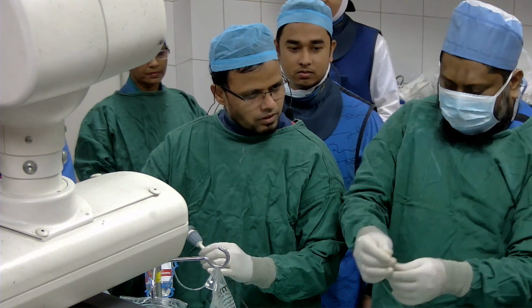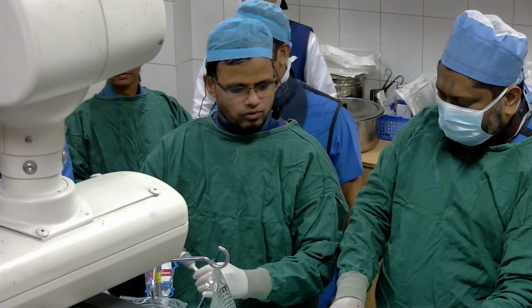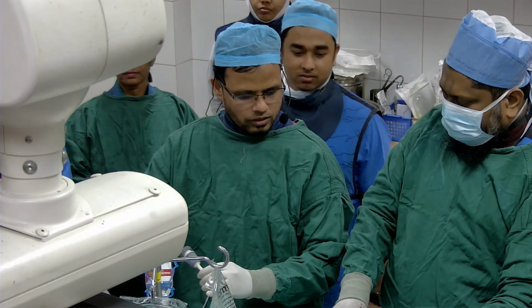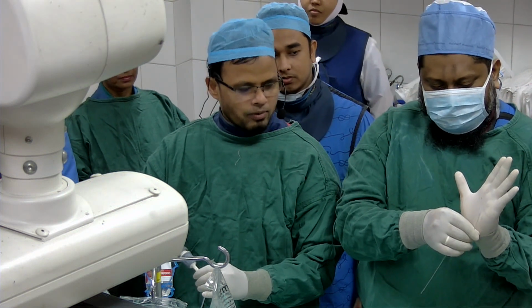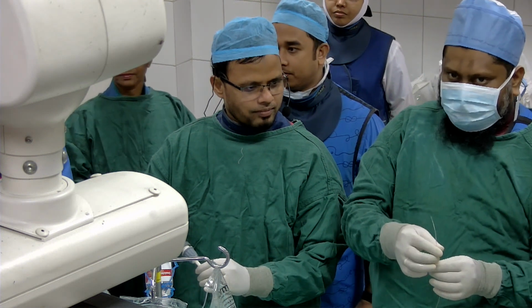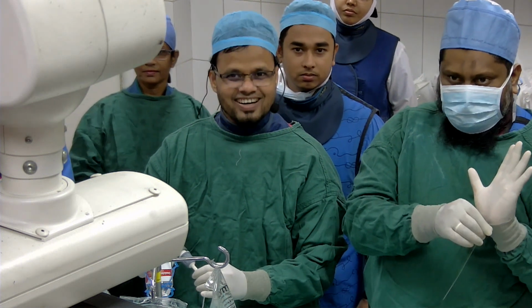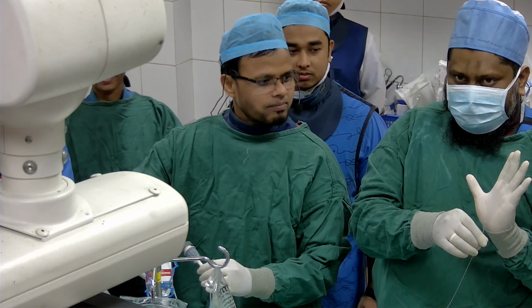Okay, great. Before we put this inside the patient's body, the dye should come out at least 3 drops. Okay, so we managed to spill quite a bit. So the dye should be forcefully flushed.